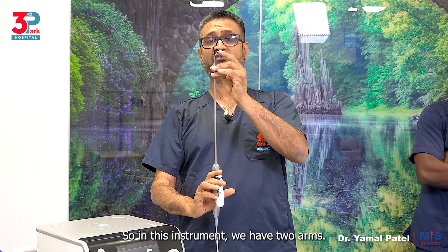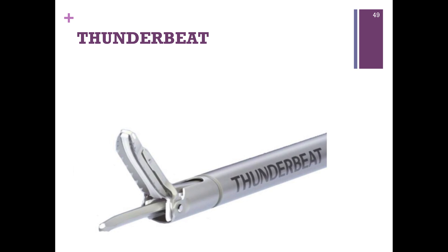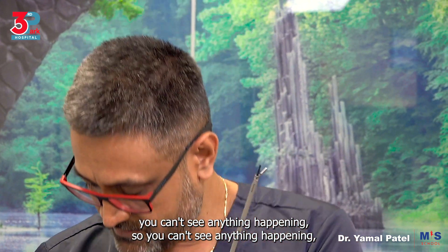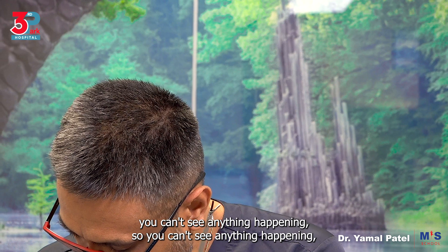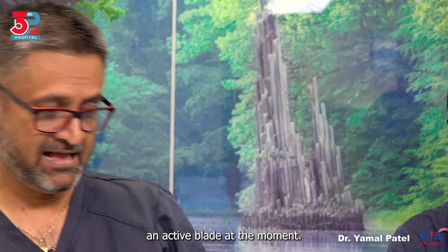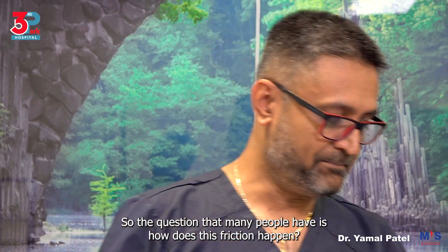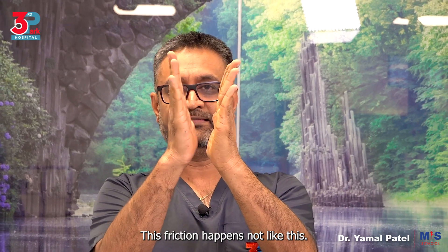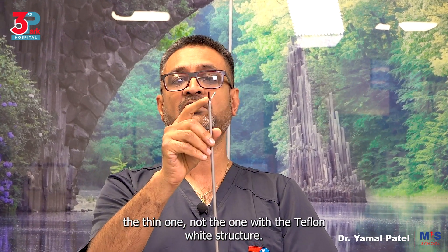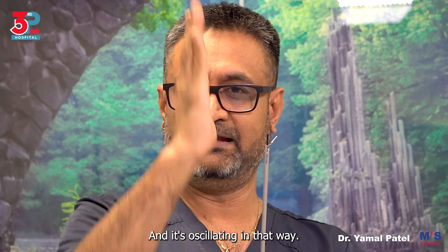In this instrument we have two arms. If you can see closely, we have one that is mobile and one that is straight. When I activate this instrument you can't see anything happening — but actually this is an active blade at the moment. The question many people have is: which is the active blade? The straight one, the thin one — not the one with the Teflon white structure. So this straight one is the one moving up and down, oscillating in that way.